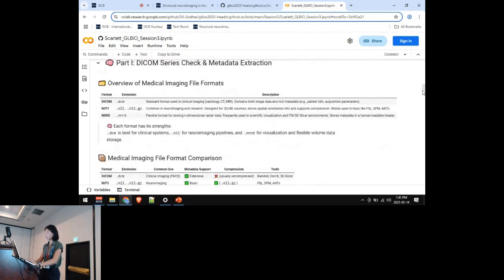Okay, so right now let's talk about CT scan formatting. The most commonly used formats are DICOM and NIfTI. DICOM is the raw CT file that you get. Once you get a CT scan, the clinician will send you a DICOM file. It's unprocessed and contains a lot of metadata. With DICOM, you'll get a folder with about 40 images in it. Each slice is an image in DICOM format, so you have to load the entire folder to get the whole scan.